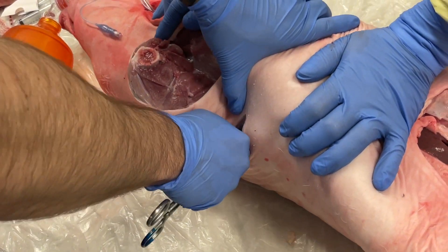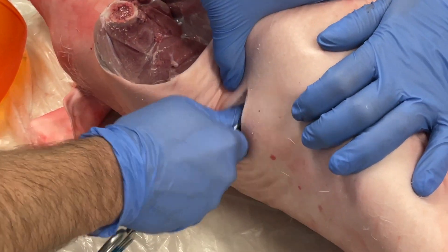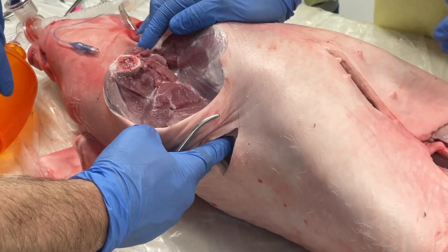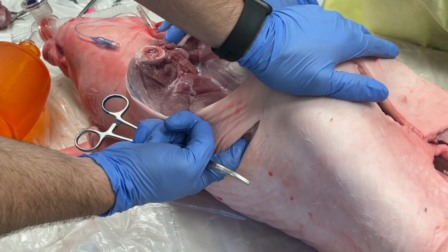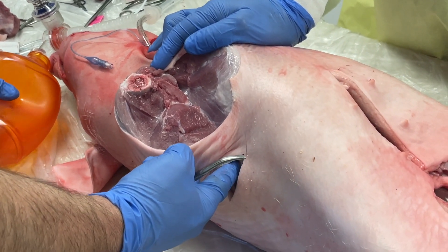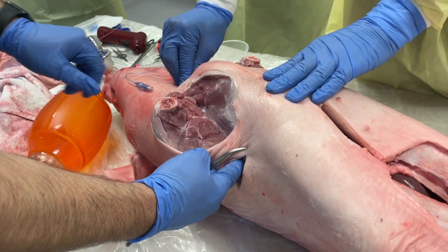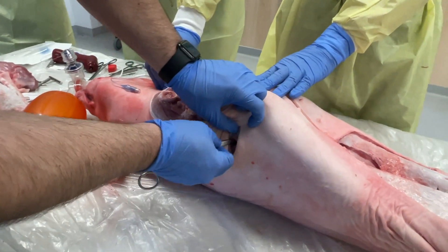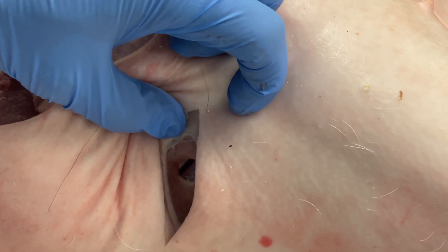And then I'm going to use an up and down blunt dissection technique to strip the muscle off the bone. So it's reasonably agricultural, but you're not going to go too far into the chest because you've got your anti-plunge grip. And then once you're through that plane, you can put your finger in to do that process and do your finger sweep. That protects you from the risk of touching a bone that you didn't know was fractured in the first place. And if you were to intubate the patient and bag them, you'll feel the lung come up against your fingers. So that's a decompressed chest — you can see there's a tract that's there, it'll stay open, and it's got less risk of retention.